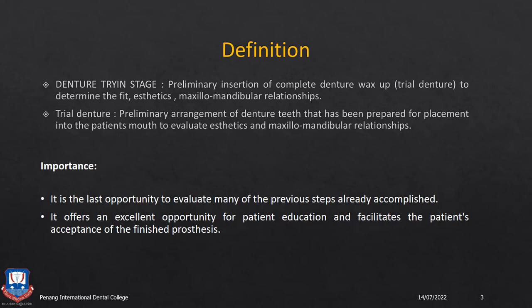So this is a good opportunity to let the patient know what to expect from the denture, what his expectations should be from the current trial setup that you have given him, and what he needs to do to take care of this denture, and what needs to be done to be rehabilitated at the earliest with these dentures before the final process is finished. So it is more like a two-way communication between the dentist and the patient, and when both are satisfied, the denture can be finalized and the acrylization and finishing of the denture can begin.